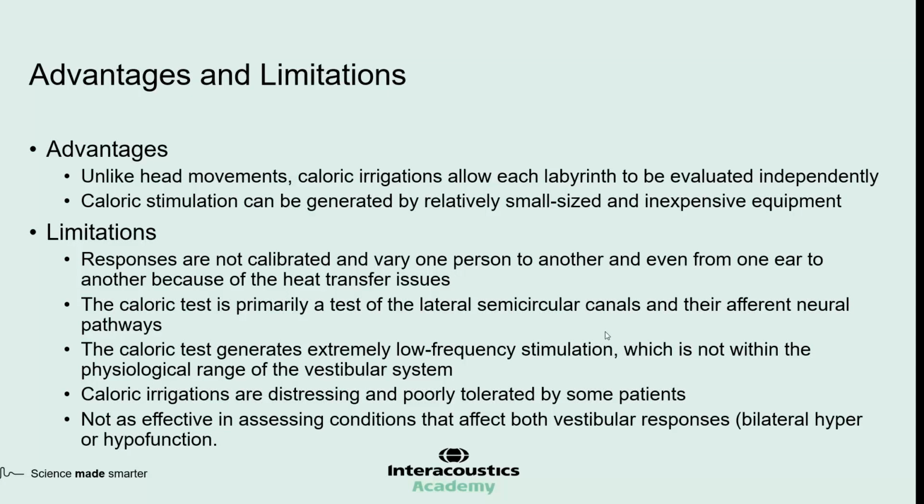Also, caloric stimulation can be generated by relatively small and inexpensive equipment. Compared to a rotation chair, caloric stimulation can be delivered in a much smaller area.